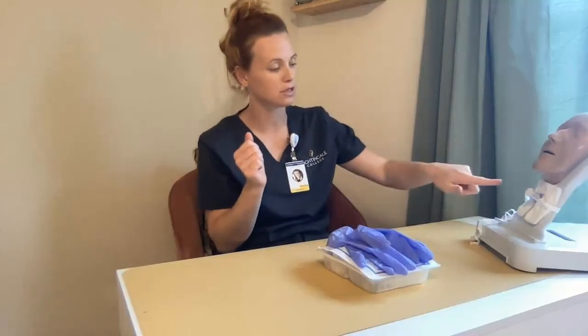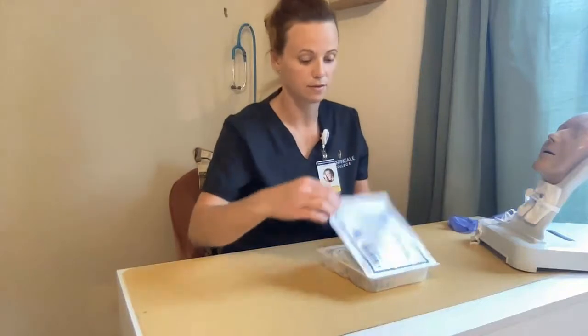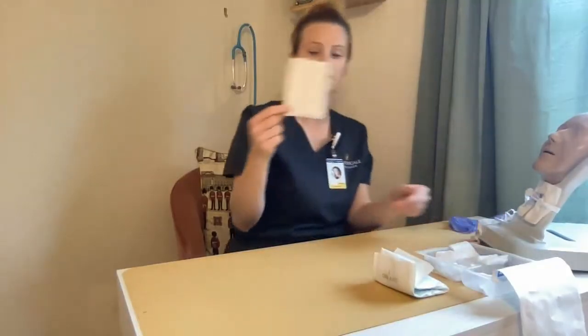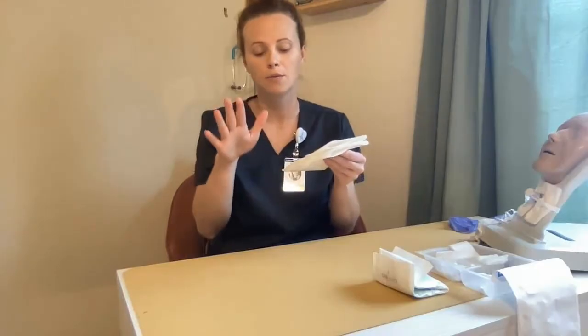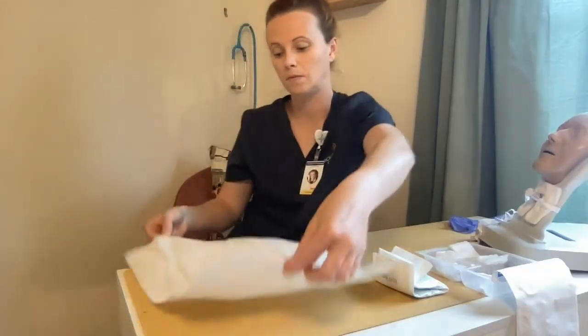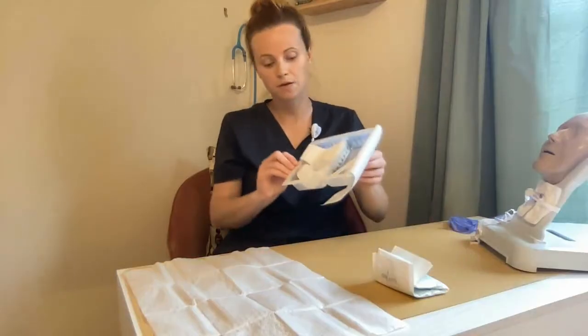I want to suction the tracheostomy if need be, and then I'm going to set up my sterile field. When opening up my sterile field, I want to ensure that I only touch the outside portion, or that one-inch border. The shiny part is the outside portion that will go on the table here.